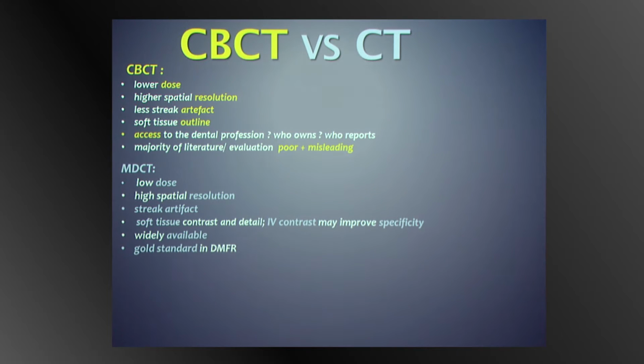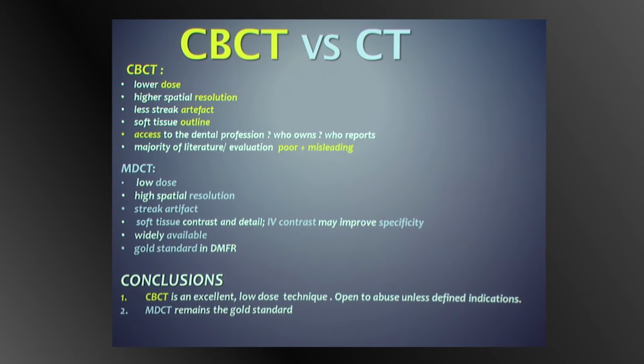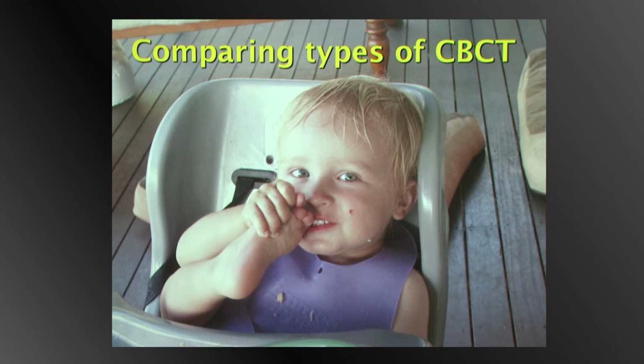CT is widely available. The majority of the literature pertaining to cone beam is poor, and multi-detector CT is the gold standard in dental and maxillofacial radiology. So cone beam is an excellent low-dose technique, but it's open to abuse unless you define the indications. And multi-detector CT remains the gold standard.